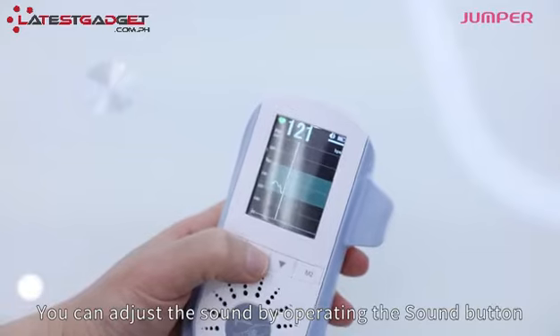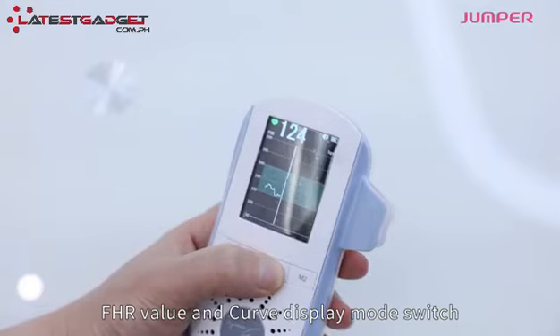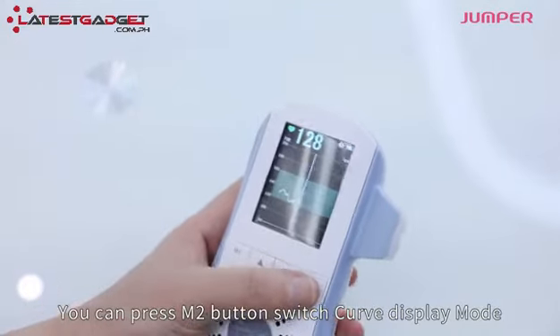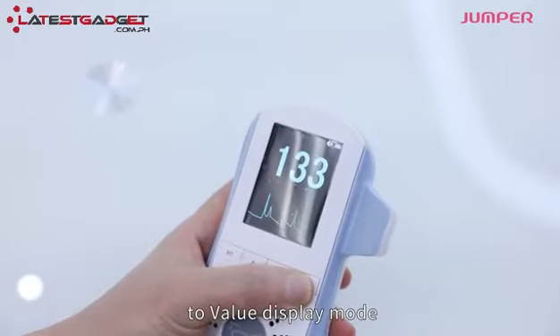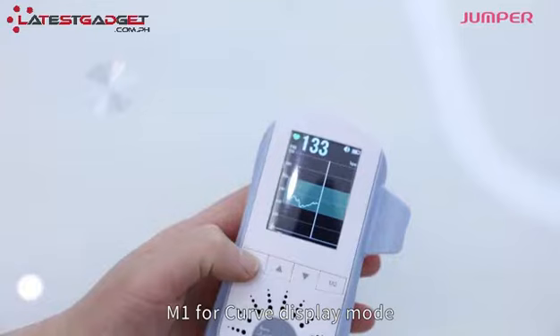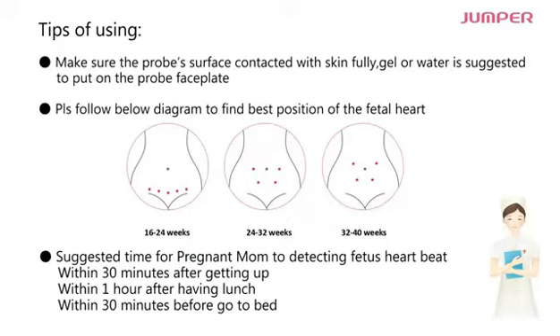You can adjust the sound by operating the sound button, FHR value and curve display mode switch. You can press the M2 button to switch curve display mode to value display mode. M2 for value display mode, M1 for curve display mode. Tips of using: make sure the probe surface contacts the skin fully.